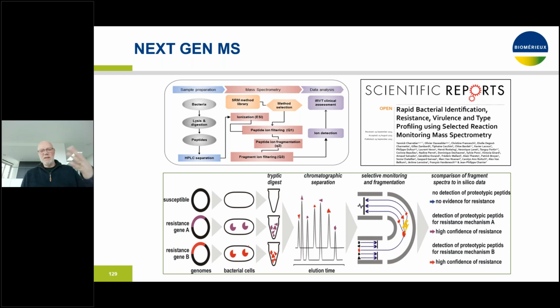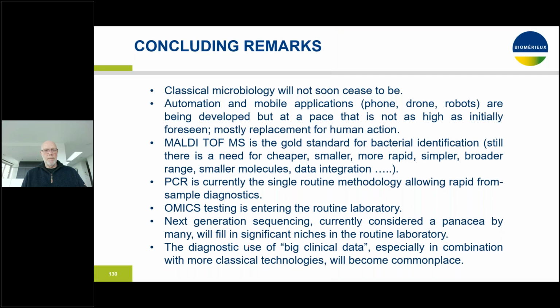The open access sample accessibility of these systems needs to be improved, because now you can only do one sample and then do the next one 45 minutes later, which is incompatible with clinical microbiology requirements. But this is going to come, and this is going to again change the field of clinical microbiology.